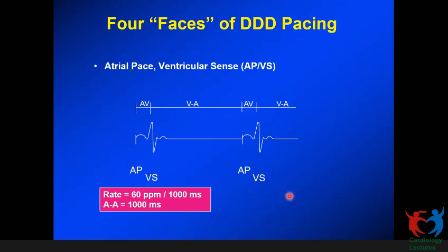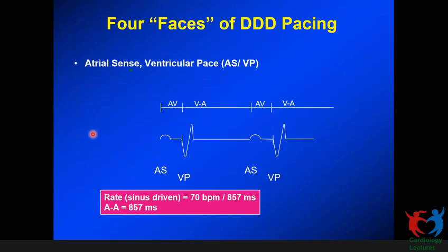And if you look at only the ECG, it will look more like AAI pacing that's going on, because you will be seeing A pace that goes on. This will be more physiologic for your patient. So this is the functional AAI pacing, if you can call it as one.